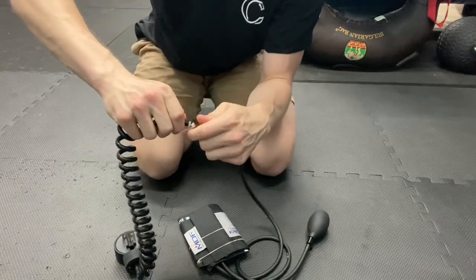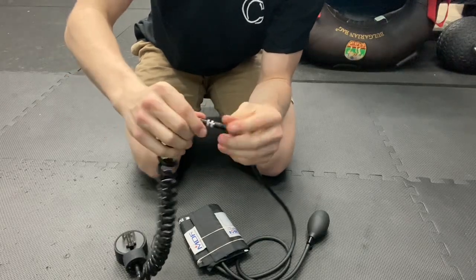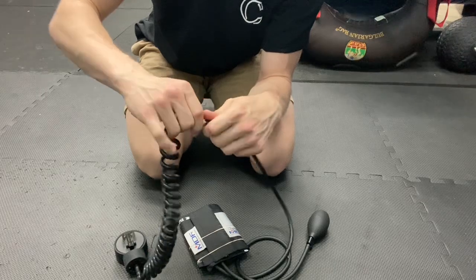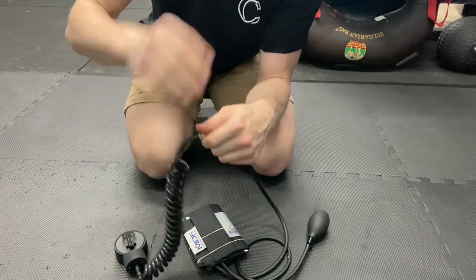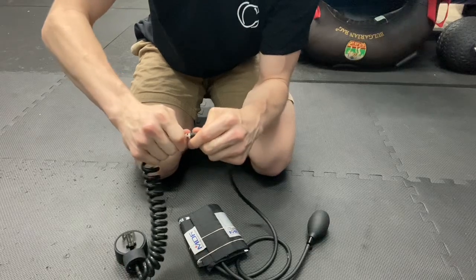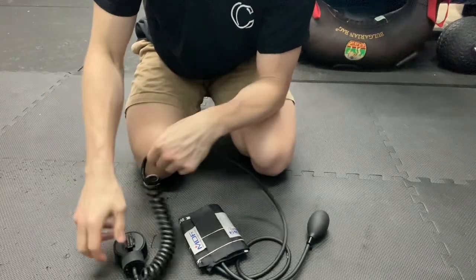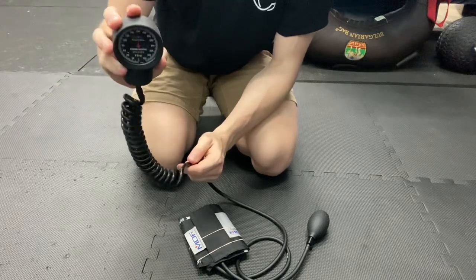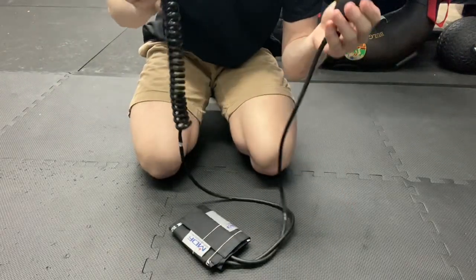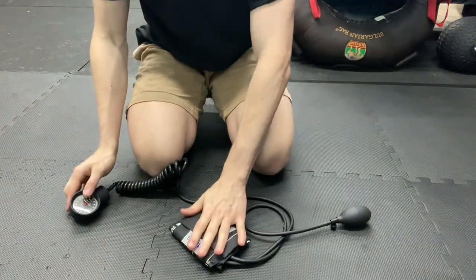So if you press them together hard enough, they should feel very snug and difficult to pull apart. You'd have to use a decent pull to get them back apart. So those are in there pretty solid. That's what it should look like. And now you have your gauge connected to your blood pressure cuff, and it should work quite well.